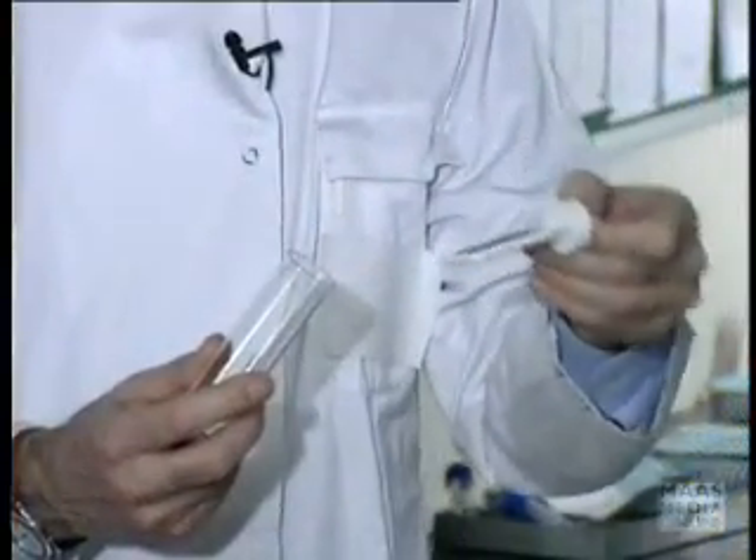Many laboratories will only process dipstick-positive urines. Make sure that the urine sample gets to the laboratory for culture within two hours of collection to avoid possible contamination. If it is going to take longer than two hours, you can store the urine at four degrees centigrade in a fridge for 24 to 48 hours, or use a dip slide such as this, or add boric acid to the urine, which prevents bacterial multiplication.